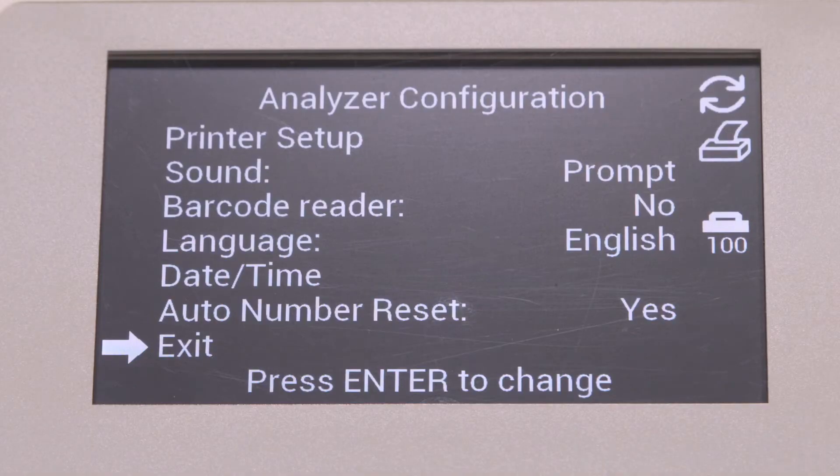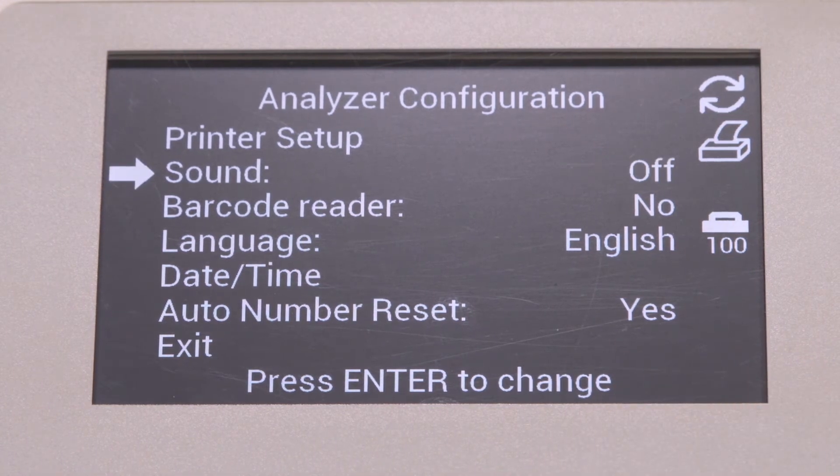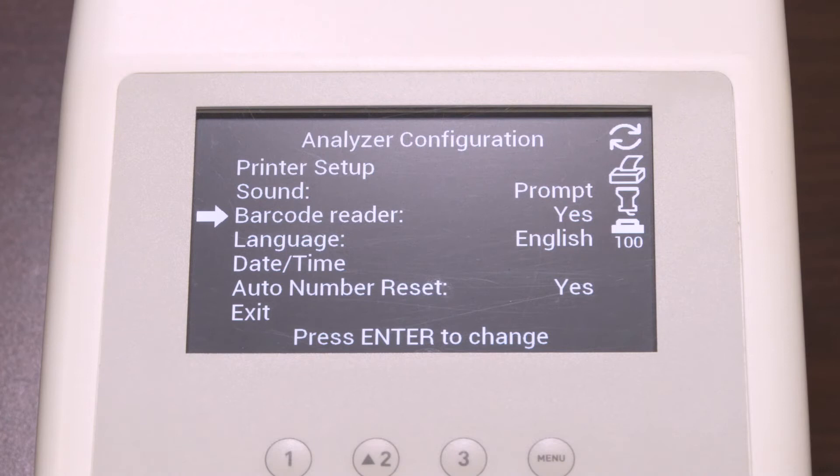Now you are back in the Analyzer configuration screen. Select Sound and press Enter to cycle the options to Off, On, and Prompts. You also have the ability to use a barcode reader. Select the barcode reader and press Enter to display Yes, allowing use of a barcode; press Enter to cycle between Yes or No. The barcode reader needs to be set to Yes in order to manually enter patient ID numbers — at the time of the test, the analyzer will prompt you to enter the patient ID using the numeral keys. If the optional barcode reader is not present and you do not use patient ID numbers, this setting can be set to No.